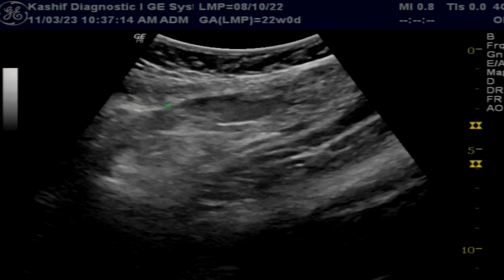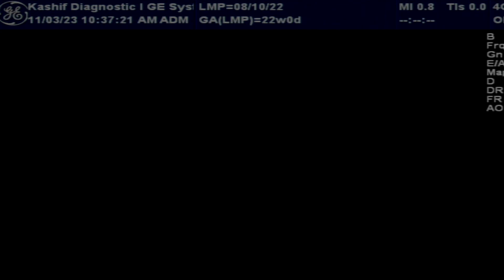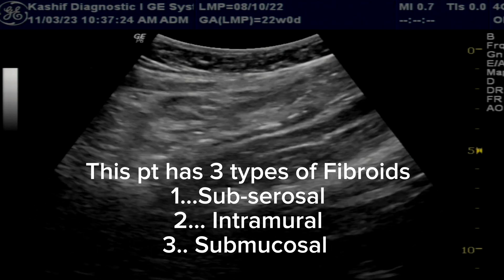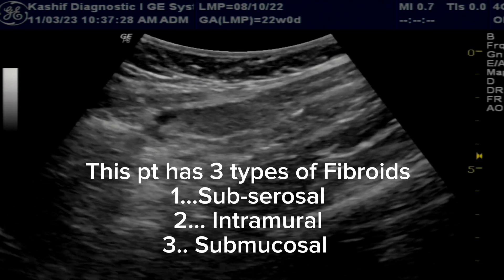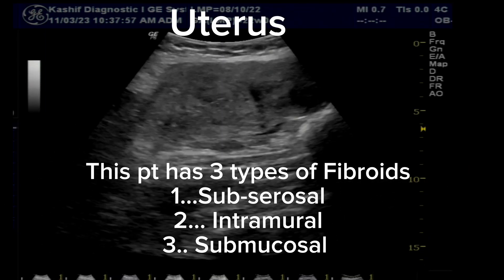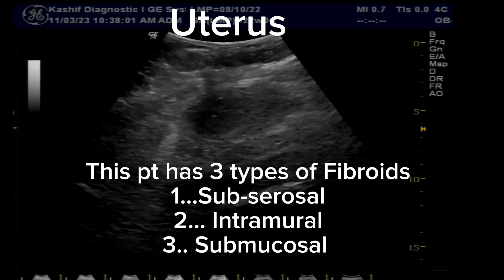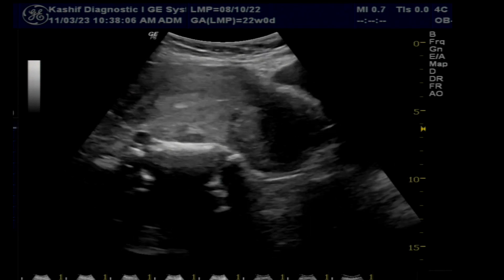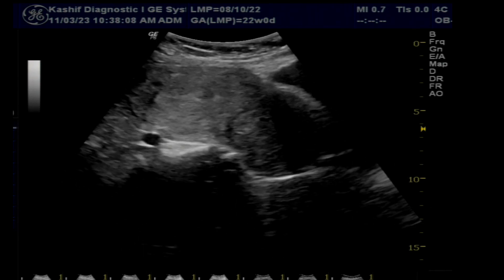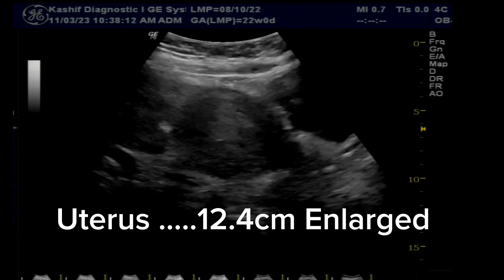This is a Day 13 scan and there are no prominent or growing follicles seen. It is observed that many patients with multiple fibroids have small follicles and some hormonal imbalance, possibly due to stress and the long hormonal treatments the patient has undergone.